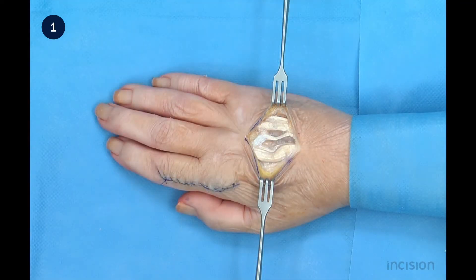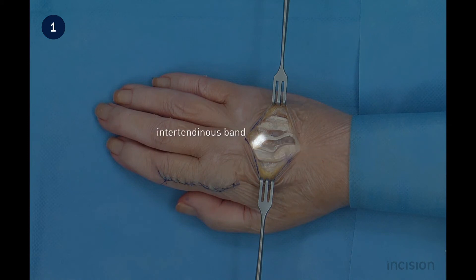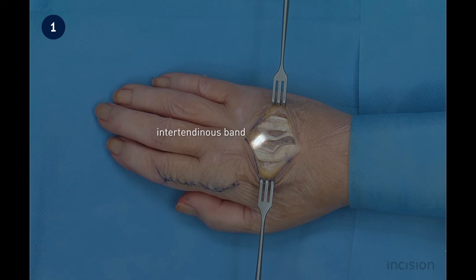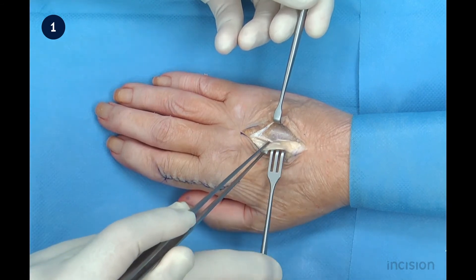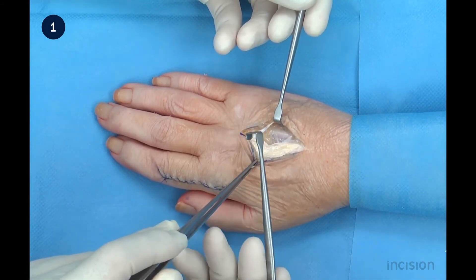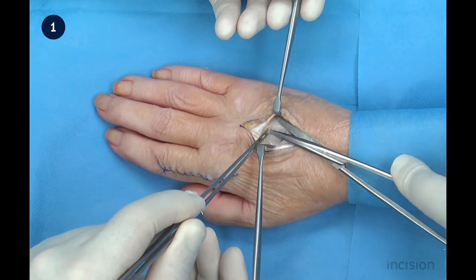The fascia of the hand is dissected to free all the extensor tendons overlying the periosteum. This image shows all the free tendons after dissection of the fascia. Note the extensor digitorum to the middle finger as well as the intertendinous band connecting the tendons of the third and fourth fingers. The extensor tendons are retracted together with surrounding loose connective tissue to either side of the wound.